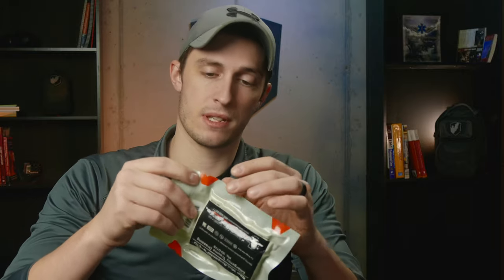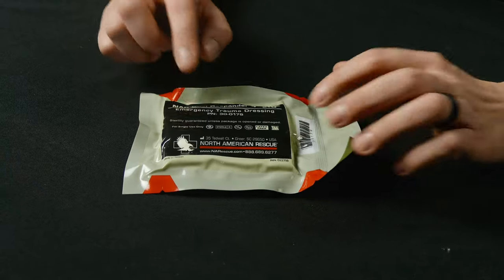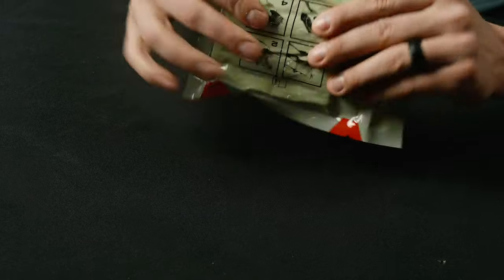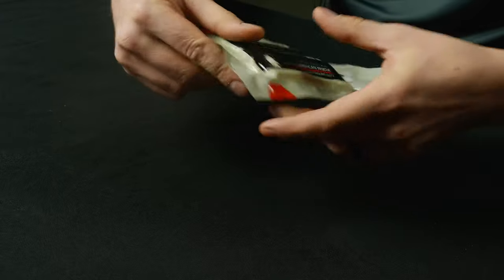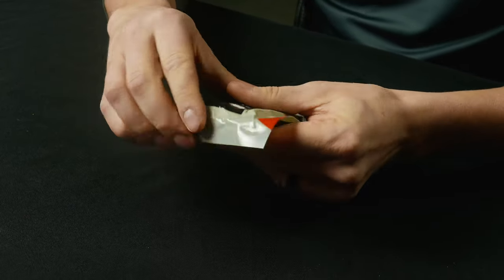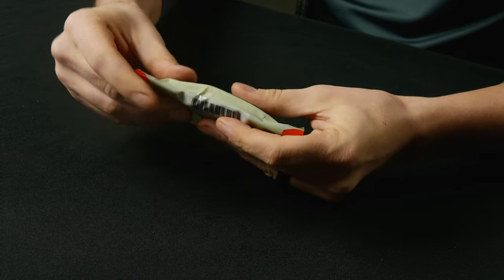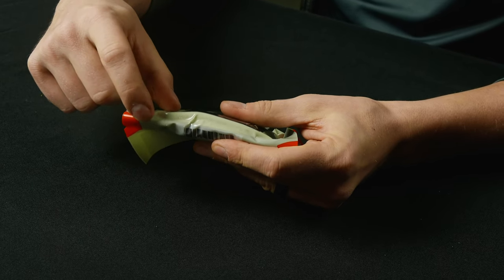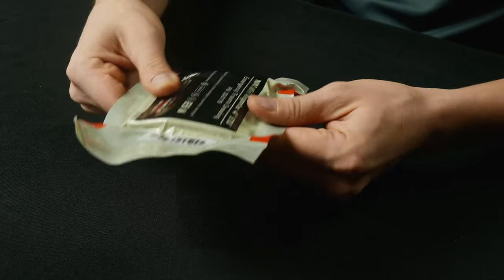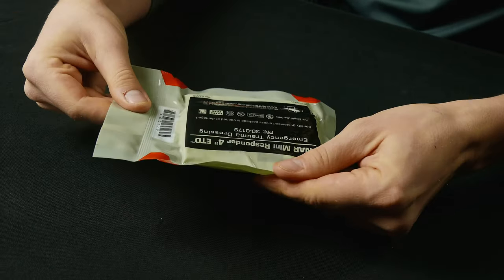So I'm going to go ahead and open this up and we'll take a look. This 4-inch ETD is in a vacuum-sealed bag. It's a flat fold, so it's much flatter for putting in compact medical kits. You can also take this excess plastic and wrap it around, but you do have to be careful — if you wrap too much, you'll end up getting a crease or a hole and you'll lose the vacuum sealing. But overall, it's pretty flat and easy to put in a med kit.